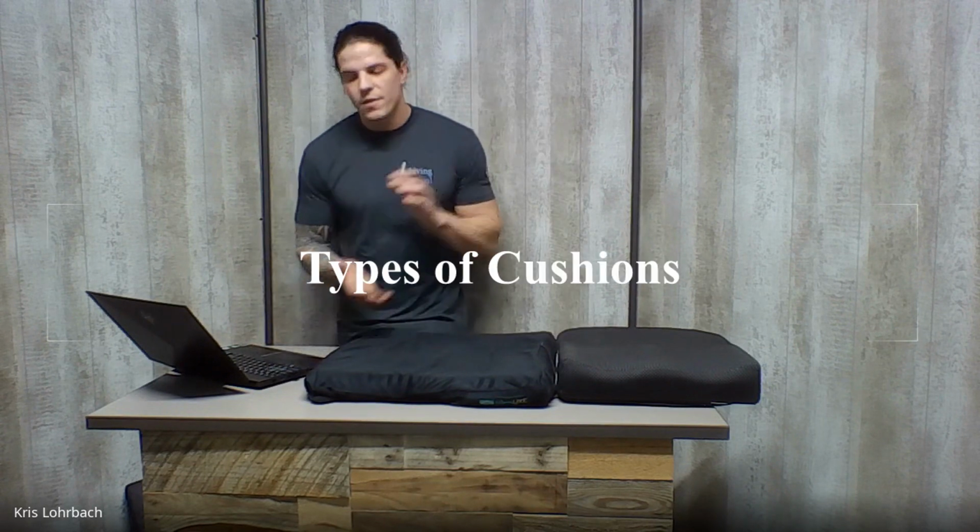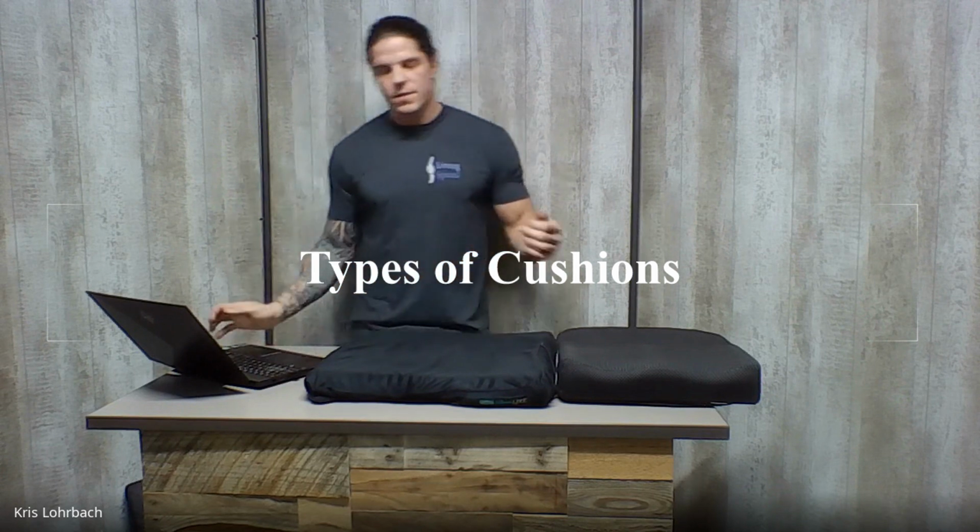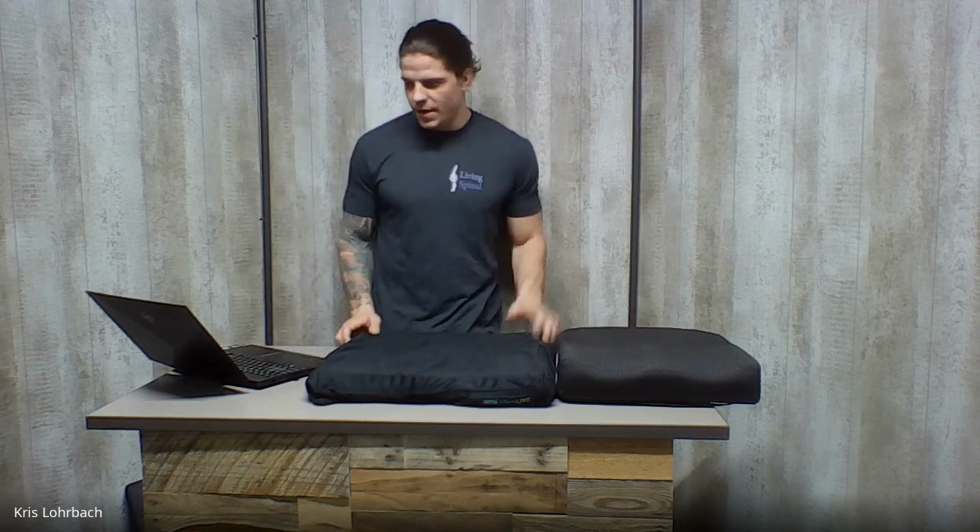So briefly, we'll go through the different types of cushions now. It's really easy to say, oh, there's 5 types of cushions, there's 3 types of cushions, but there's a lot of types of cushions. In general, there's air cushions, gel cushions, fluid cushions, foam cushions, hybrid cushions, which just means a combination of any of those. And then there's also honeycomb cushions, which is mostly just the brand Supercore. But I'll go through each one basically.